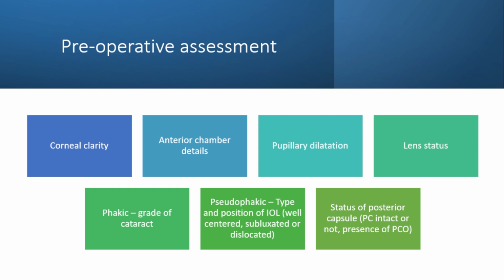So it's important that you must calculate the IOL power and keep it with you. So in case you're able to put an IOL at the same time, go ahead and do it, okay? So if there's a RD, you can always argue that you cannot put an IOL at the same time because you can't calculate the IOL power.